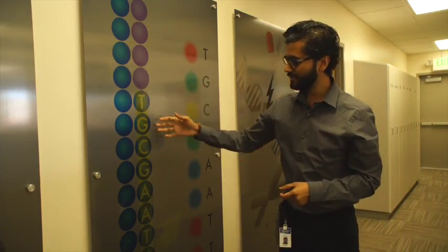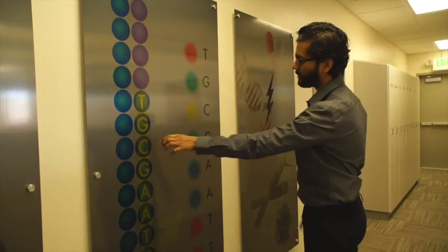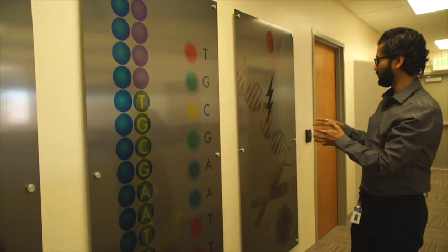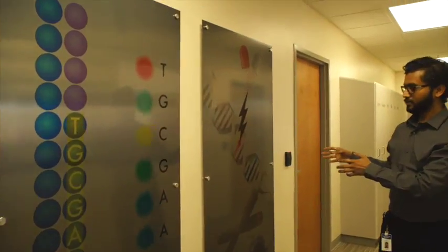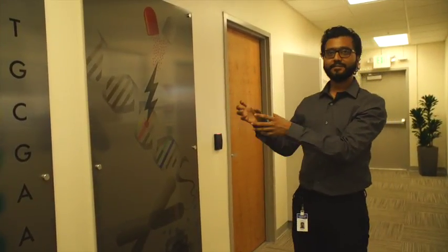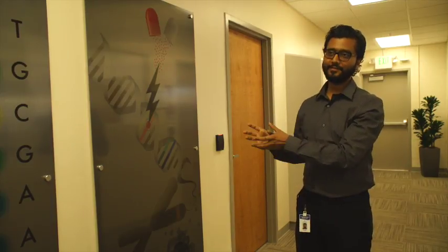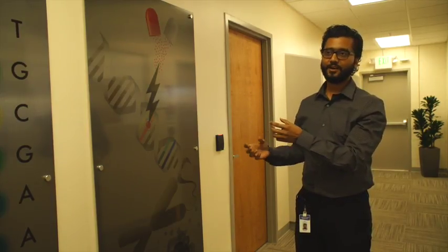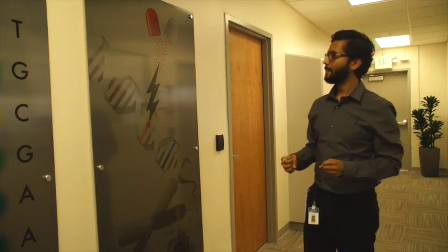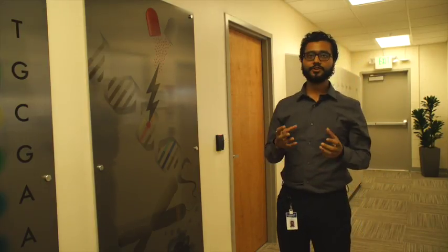So as you can see here, if for example we were able to pick up some mutation, our next goal is, okay, now that we know that there's a mutation, to take that mutation and match a drug against it. We know that that mutation downstream will cause a lot of problems, which is what this patient is facing right now. But what we do is we have this internal molecular tumor board, right?